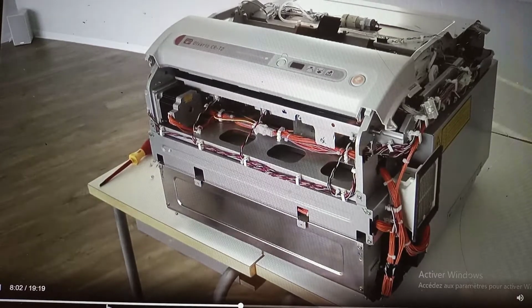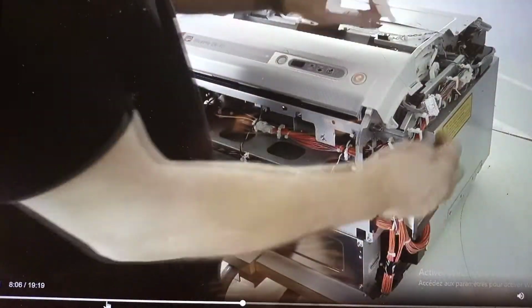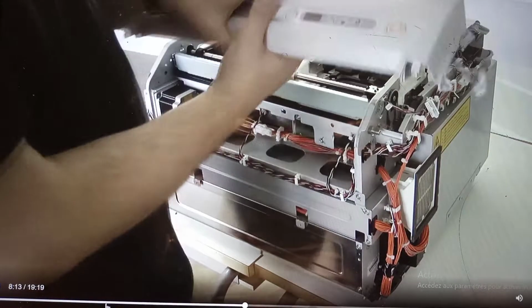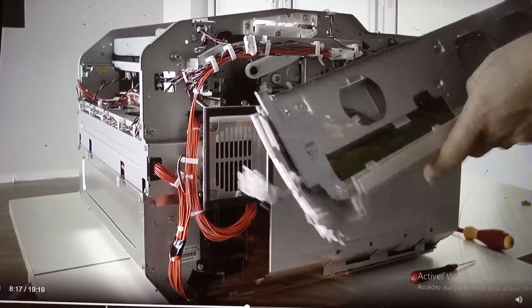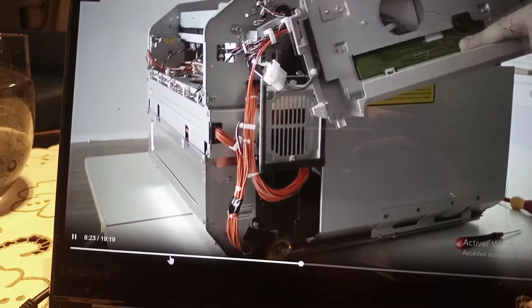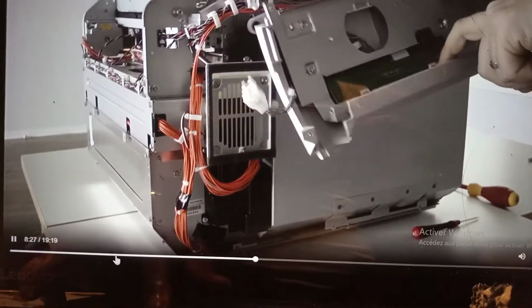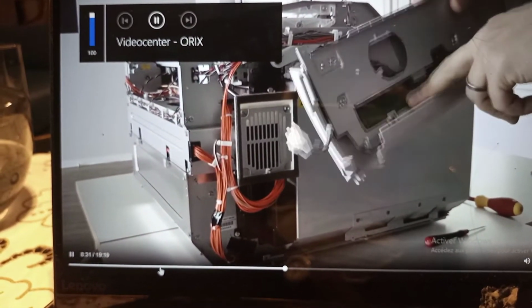Just remember, before removing the part with buttons and display, to disconnect this connection here on the side, and then it's possible to remove. So after removing the top plate with the buttons and LEDs, we can see the back side. It's a P&L board, so in case of a defective button, LED or display, this board needs to be changed.